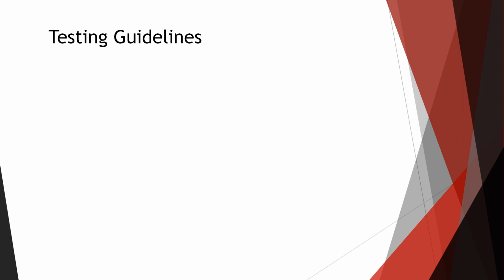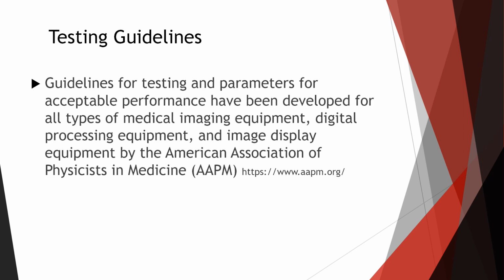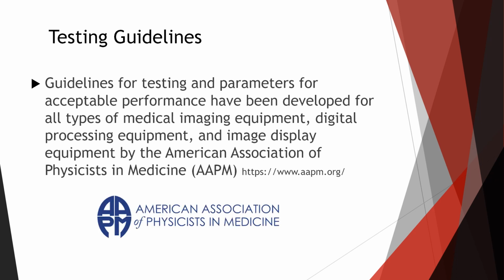Let's get started by talking about testing guidelines. Guidelines for testing and parameters for acceptable performance have been developed for all types of medical imaging equipment, digital processing equipment, and image display equipment by the American Association of Physicists in Medicine, which is made up of medical physicists. A medical physicist is someone who develops and maintains quality assurance programs to ensure high quality imaging in radiology. When we say physicist, it's referring to a medical physicist. And this is our symbol here.